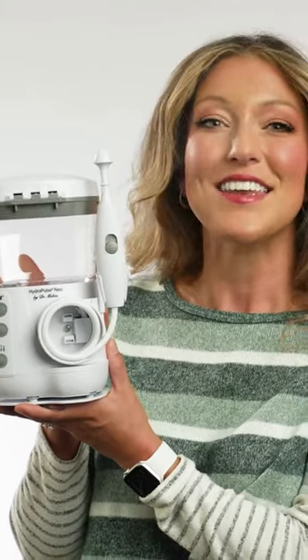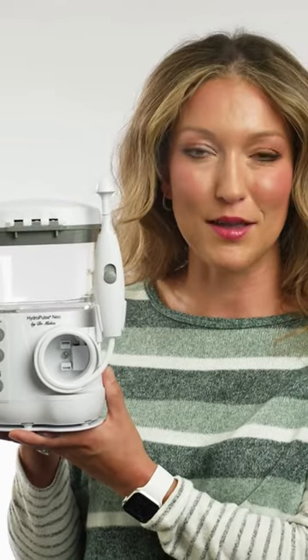It's all natural and drug-free. NealMed is the number one physician-recommended brand for nasal care.